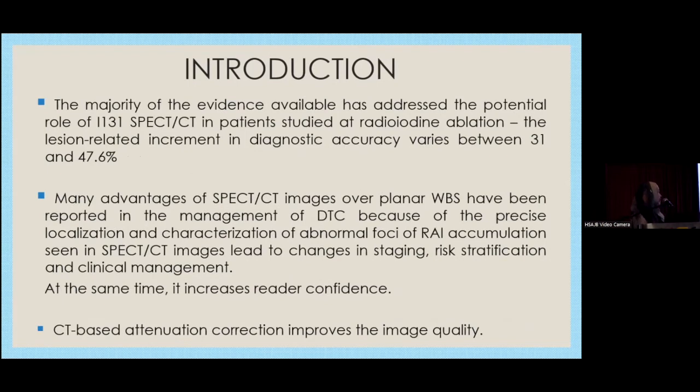And as we know, after 2004, a lot of studies have appeared, and the majority of the evidence available has addressed the potential of iodine 131 SPECT-CT in patients studied at radioiodine ablation. I mean, there are papers regarding pre-ablation and also on follow-up. And in the majority, it shows a diagnostic accuracy which varies between 31 and almost 50% of patients.